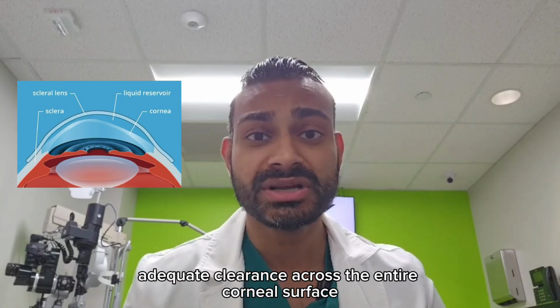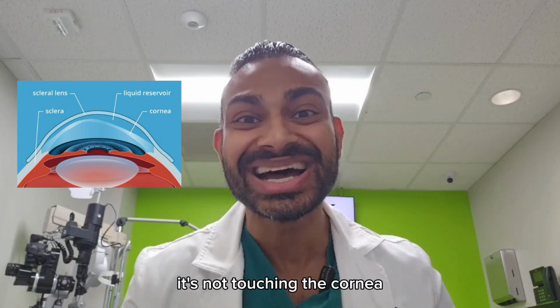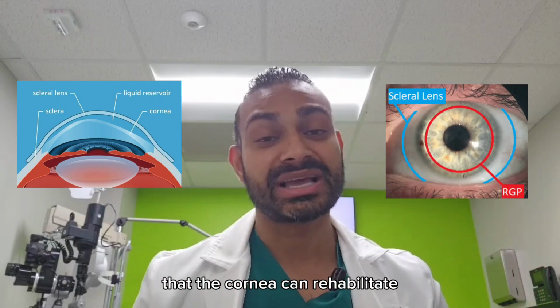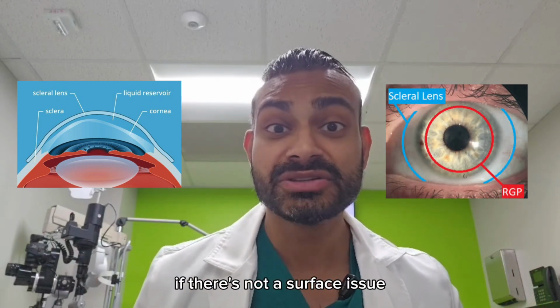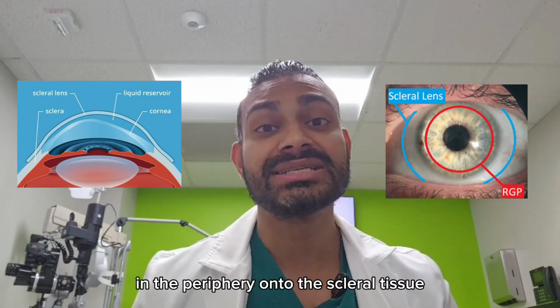And then also the central corneal and the mid-peripheral cornea, you want to make sure there's adequate clearance across the entire corneal surface. The whole point of the scleral lens is that it doesn't interact with the cornea. It's not touching the cornea. It's vaulting completely over the cornea to make sure that cornea can rehabilitate if there's a surface issue, but also to make sure the landing is completely in the periphery onto the scleral tissue.